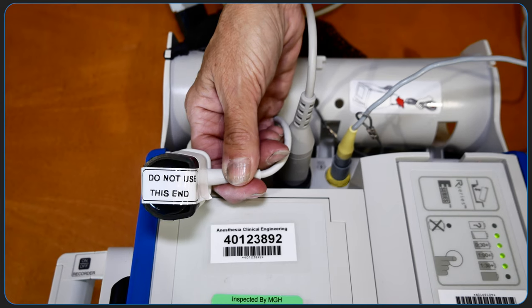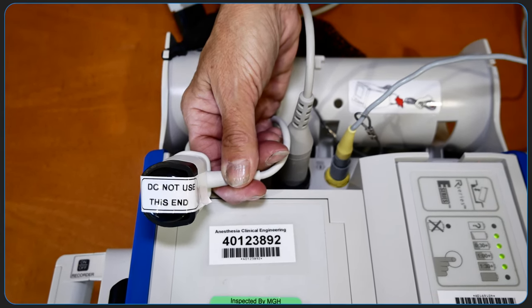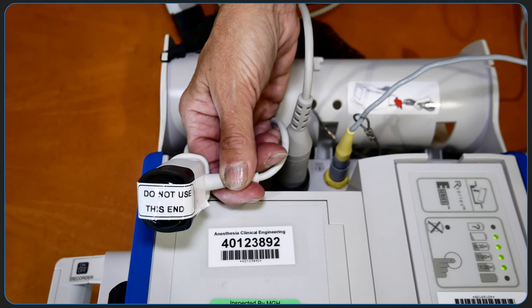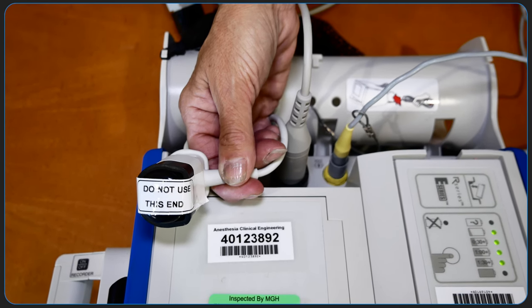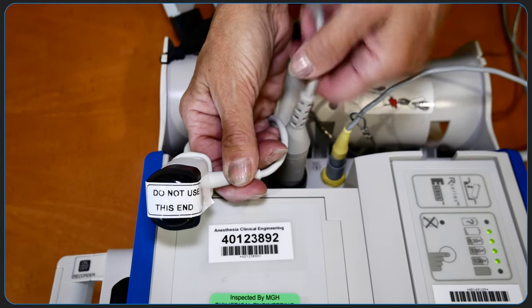This defibrillator has an option to provide feedback on chest compressions. This is only being trialed in the PICU at Mass General. The connector is covered to prevent inadvertent attachment to the 3-lead ECG connector, which is located immediately next to it.